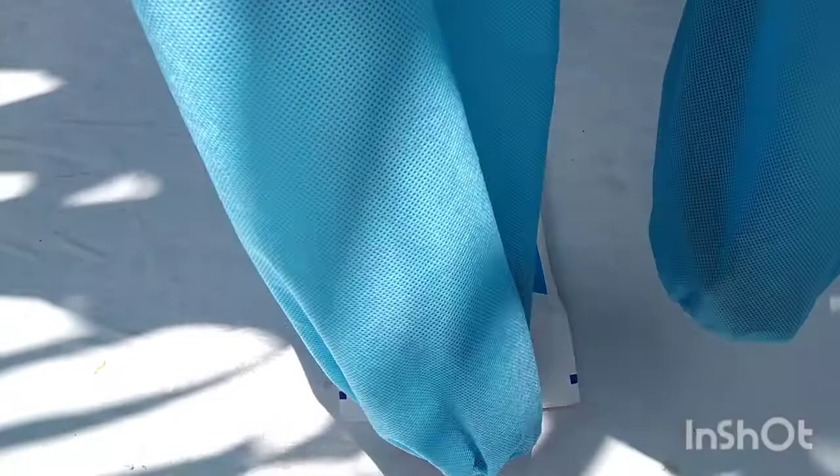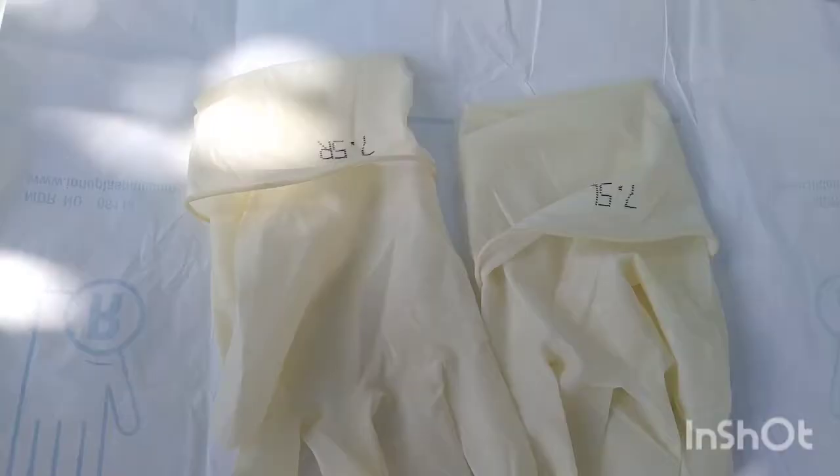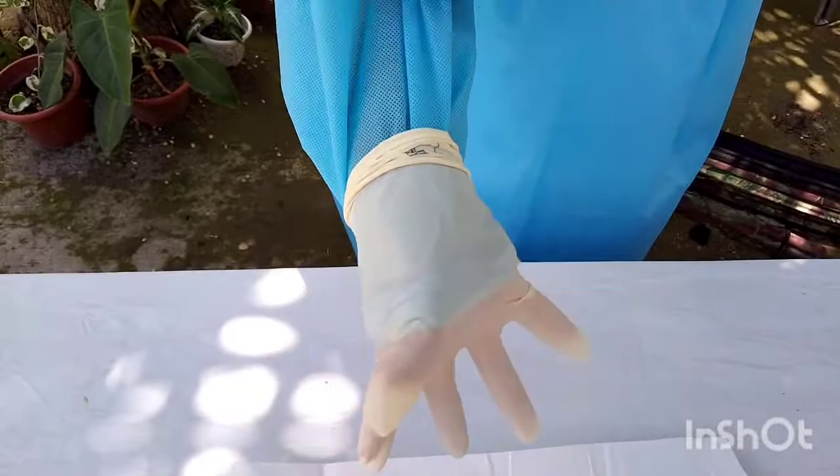After this, let's proceed to the closed gloving. For closed gloving, with hands covered by the cuffs of the gown sleeves, open the inner sterile glove package. Hands remain clean and the sterile gown cuff will touch the sterile glove surface. With the non-dominant hand inside the gown cuff, pick up the glove for the dominant hand by grasping the folded cuff. Sterile gown touches sterile glove.